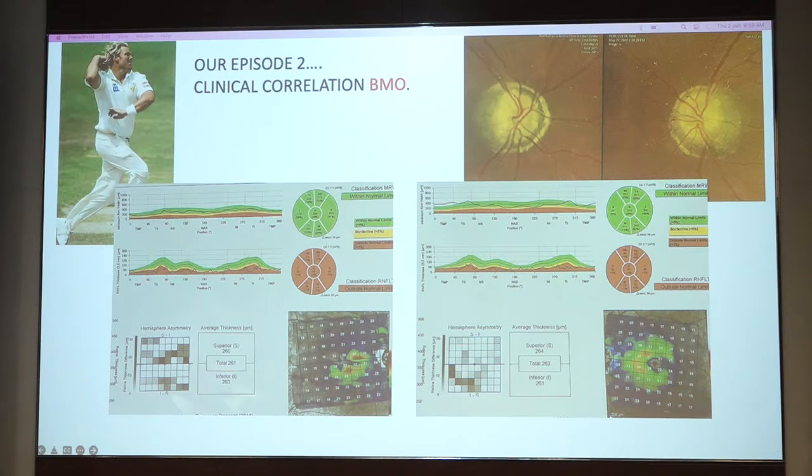Yeah. So what is this? Is this glaucoma? Sorry? Okay. I am very loud. Yeah? Oh, okay. In the recording.